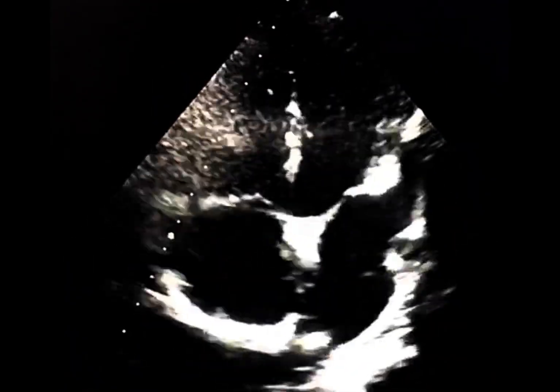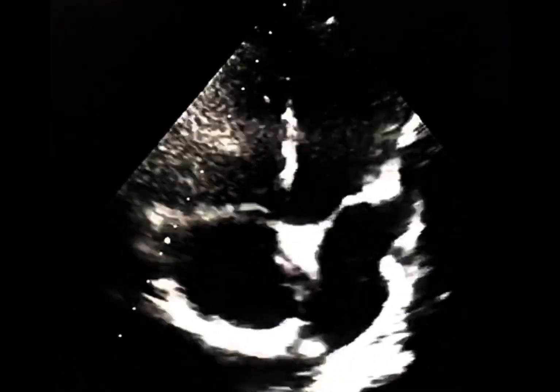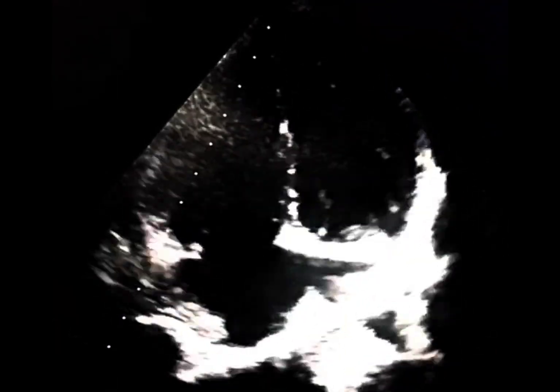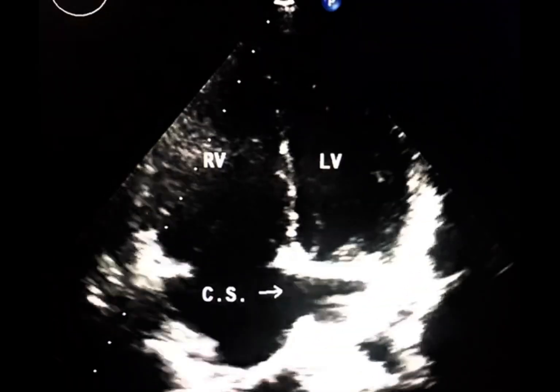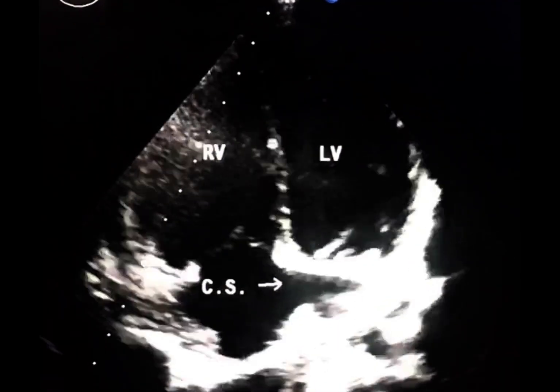In this four-chamber view, both the interatrial septum and the interventricular septum appear intact. In the four-chamber view, by tilting the probe posteriorly, the coronary sinus becomes visible.